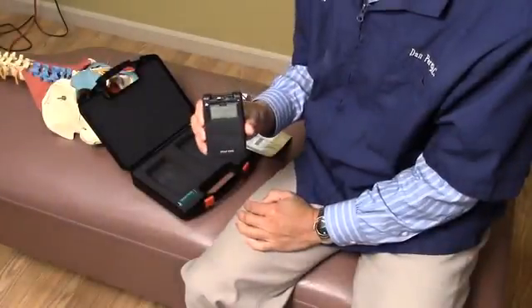Usually I recommend conservative methods to dealing with chronic or subacute pain, which would include ice and heat, massage therapy, gentle stretches, and this kind of thing. I usually advise patients to avoid taking the strong drugs because oftentimes that results in actually worse things for your body than the pain itself. But if you absolutely have to knock that pain down sooner than later, using the TENS unit is a viable option. And this is the TENS unit right here.